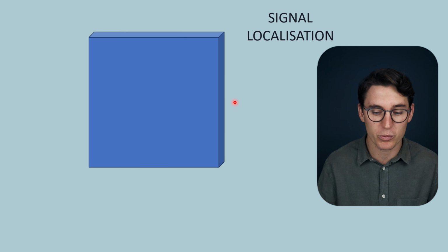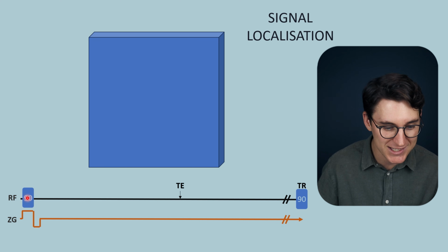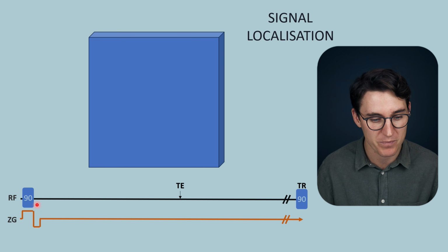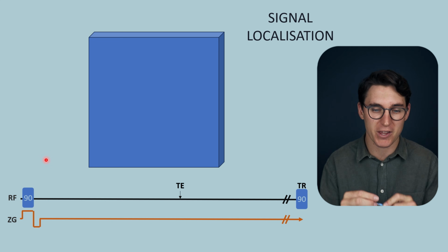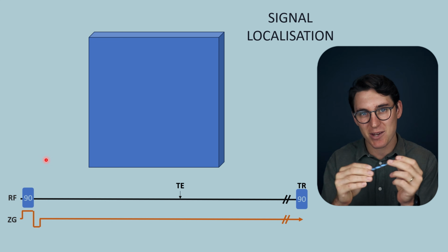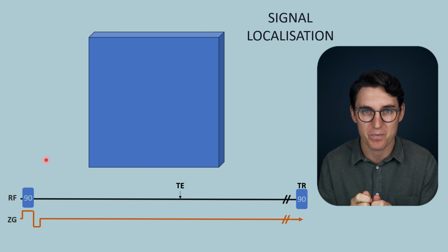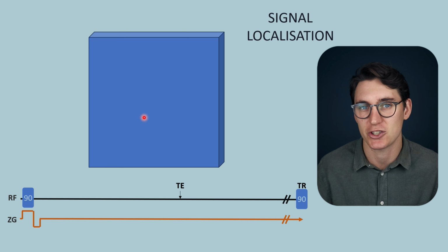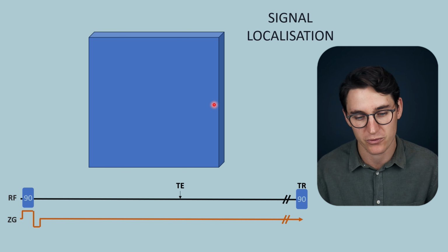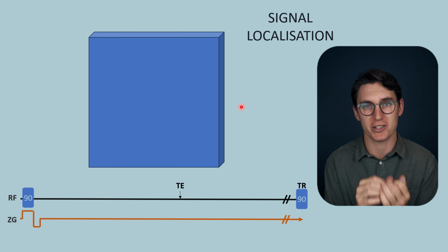So we can do what we've always done and select a specific slice. We apply a slice selection gradient in the longitudinal plane, and we match the specific slice with an RF pulse, a radio frequency pulse that has the same frequency as the precessional frequencies along the slice that we're interested in. We will only get nuclear magnetic resonance in a specific slice of tissue, as we've done in all our MRI imaging so far. Now, what happens if we apply that 90-degree RF pulse and just wait?